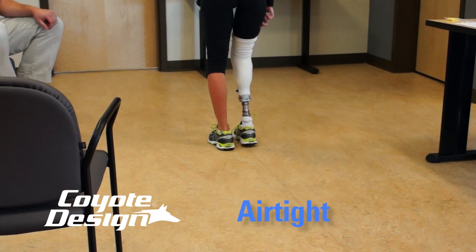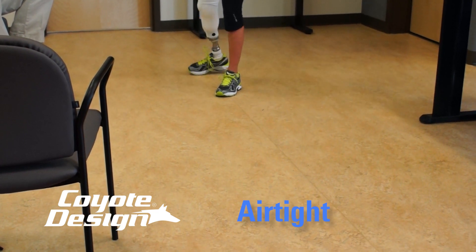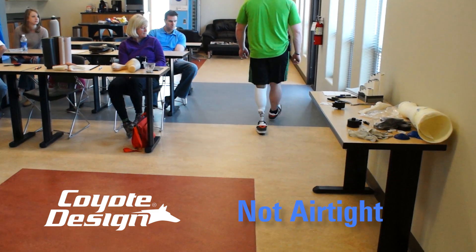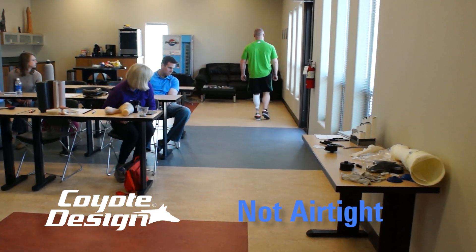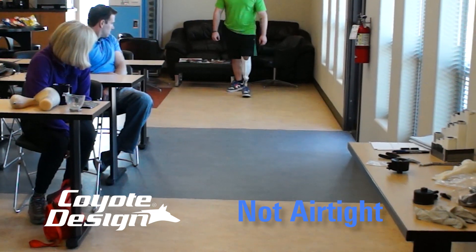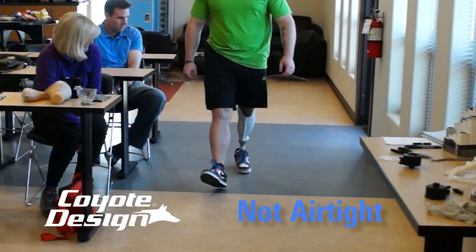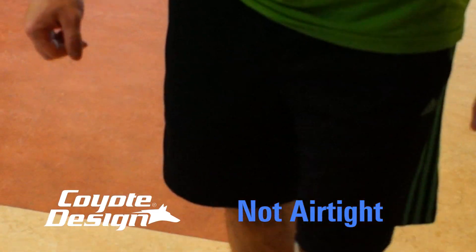This feels a little more snug. Just more with you? Yeah. I feel like I am pistoning some, because there's a little bit that happens no matter what — it's going to happen — but I feel like there's enough there now that probably within an hour or two it would start to feel it, like on the bony prominence is where it's making the impact.